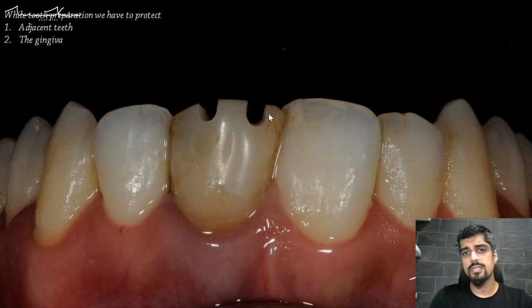If you do this without depth cutting burrs it's also okay, but you'll have less control. Depth burrs — approximately 1 to 1.2 millimeters is what I've given here, and another 0.2 to 0.3 millimeters will probably go when we do the final preparation and finishing.